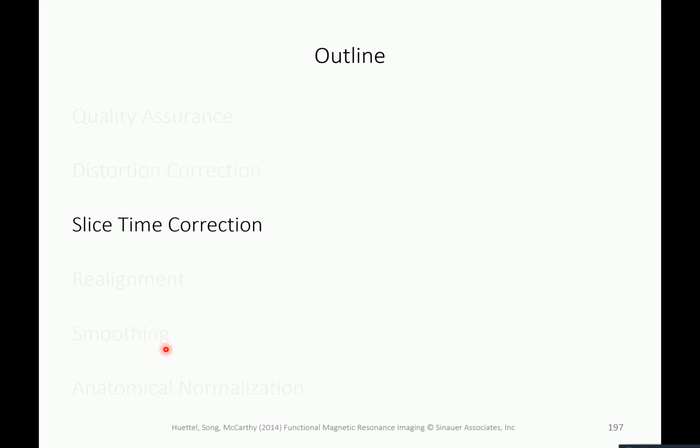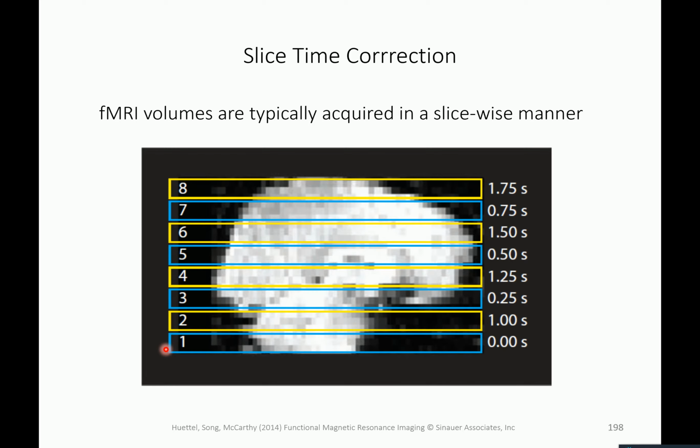How do we determine how many slices we want, and what implications does that have? This essentially depends on how much you want to image. Here the idea is that you do full brain imaging, so you acquire slices that cover the entire brain. If your field of view in 3D is like this, that has certain constrictions on how fast you can do that.